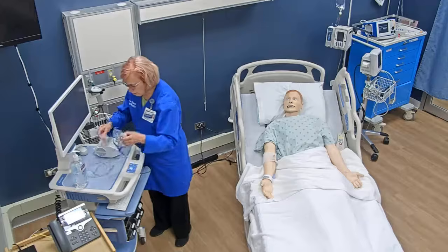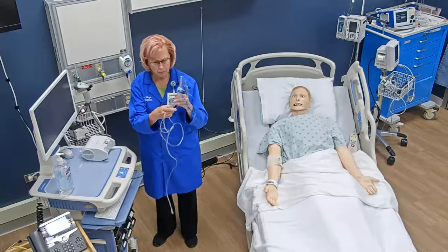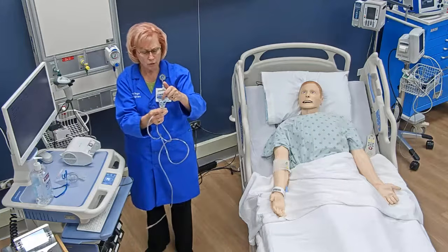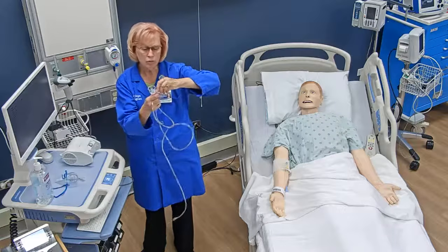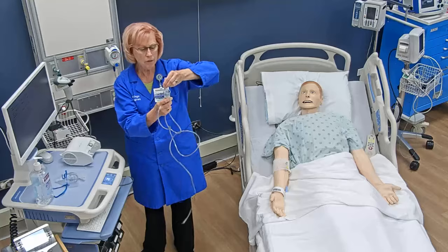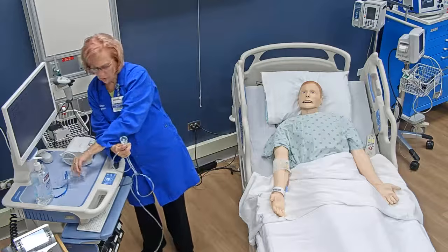I start administration by getting the nebulizer mask, and I have to take the top part off of the bottom part. So I'm left here with this little cup and with a little center spot right here where the oxygen or the air flows. This is a little plastic vial. I open this by twisting the top and squirting the fluid into the cup until it's all in there. Make sure you get all the medicine in, and make sure you hold it upright so it doesn't spill.